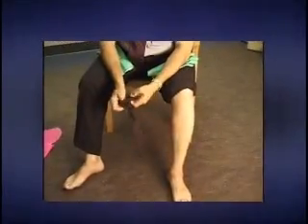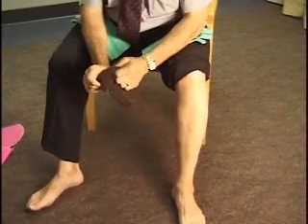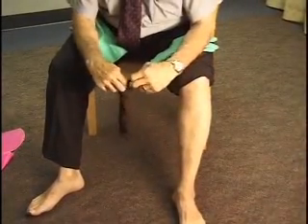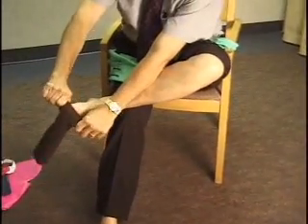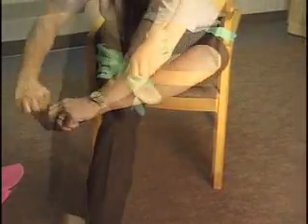Here we see a common method of applying a closed-toe stocking. First, it is turned out down to the heel. Next, care is taken to make sure there are no folds or wrinkles in the foot part of the stocking. It is then rocked back and forth over the foot, and here in this patient there's a large hammer toe which has to be negotiated.